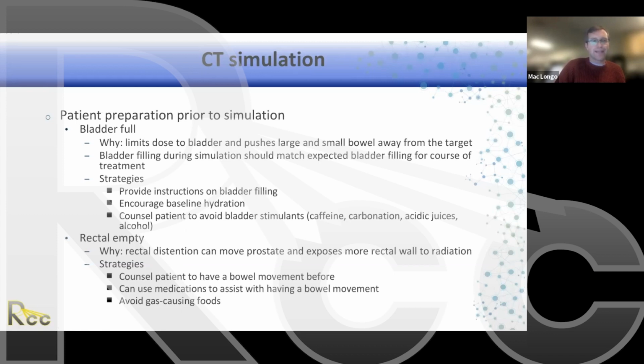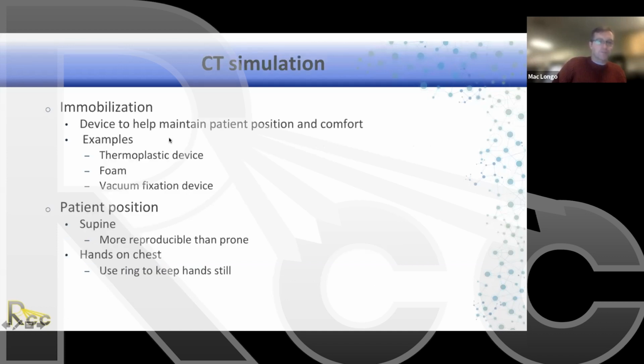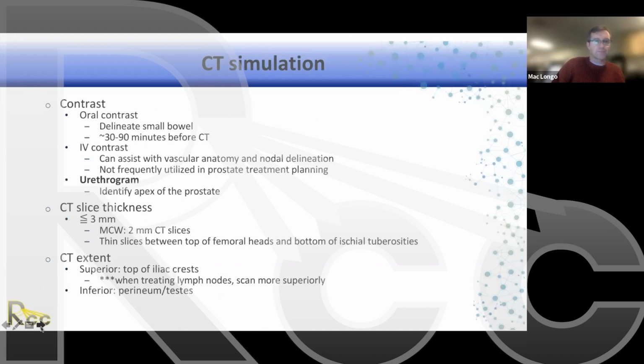up their diagnostic imaging to see, hey, is this the way this gentleman's rectum usually is, or is this just today it's abnormally full or abnormally gassy, or the bladder isn't empty? So using those diagnostic imaging studies to help learn if this is consistent or an aberrancy for the patient. We of course immobilize the patient, and I think you are all well versed in this, so we can just breeze through that. The use of contrast is interesting.